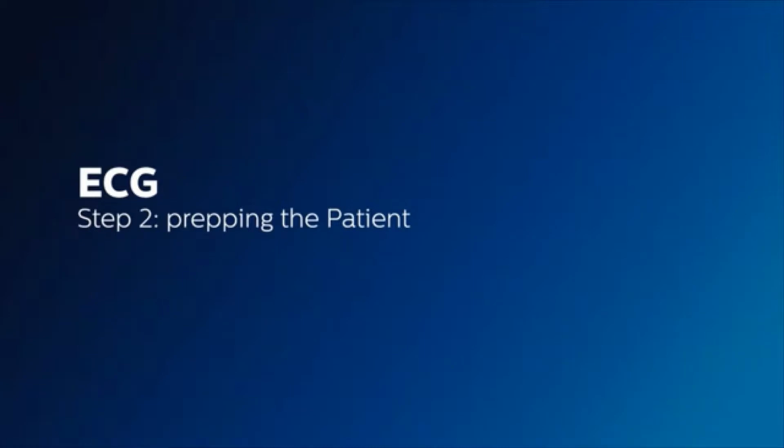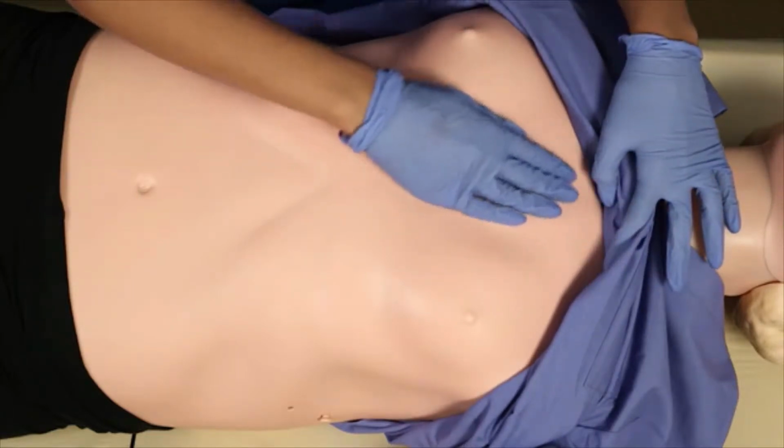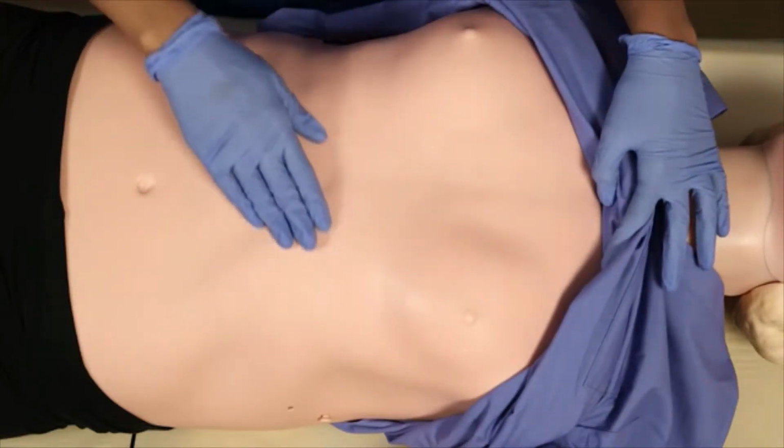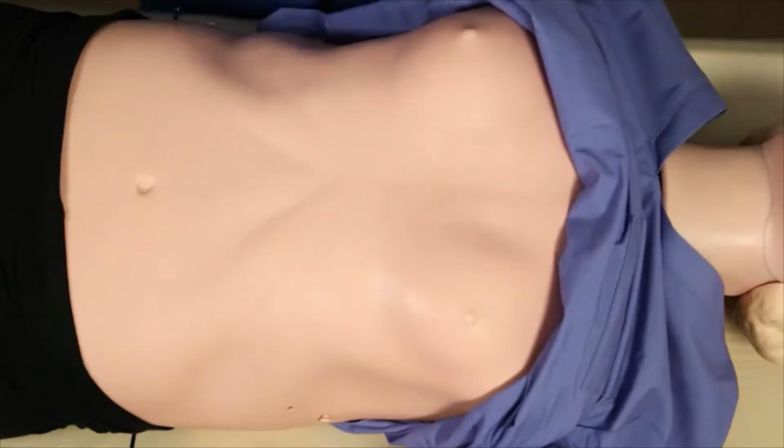After you have chosen which cable and quattrodes to use, the next step is to prep the patient. It is important to shave any patients with excessive hair. If the hair creates an arc behind the quattrode, it can be a burn hazard.